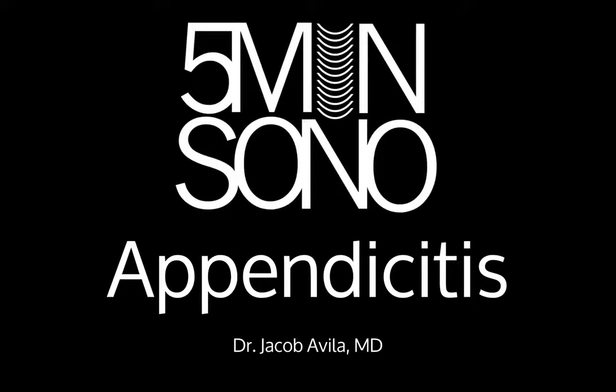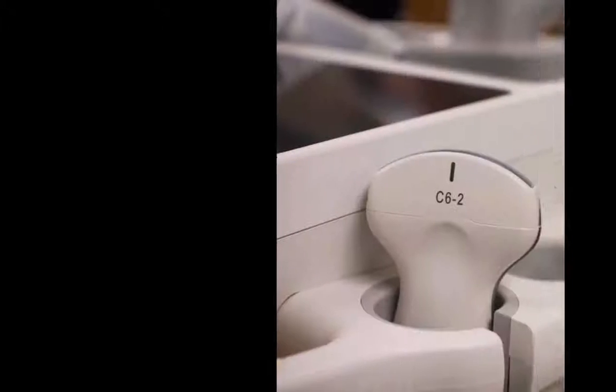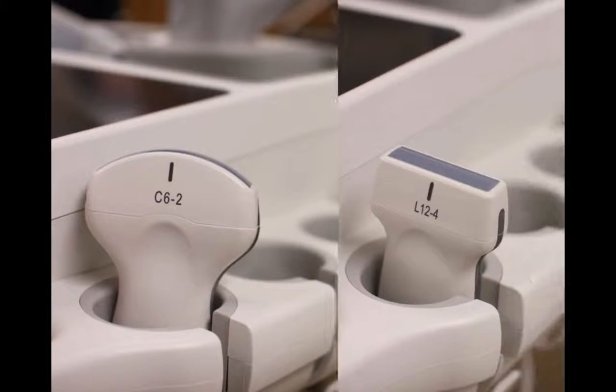Hi, this is Jacob Avila of 5 Minute Sono, and today we're going to learn how to use ultrasound to look for appendicitis. Your probe of choice for this examination is going to be the curvilinear or the linear probe.